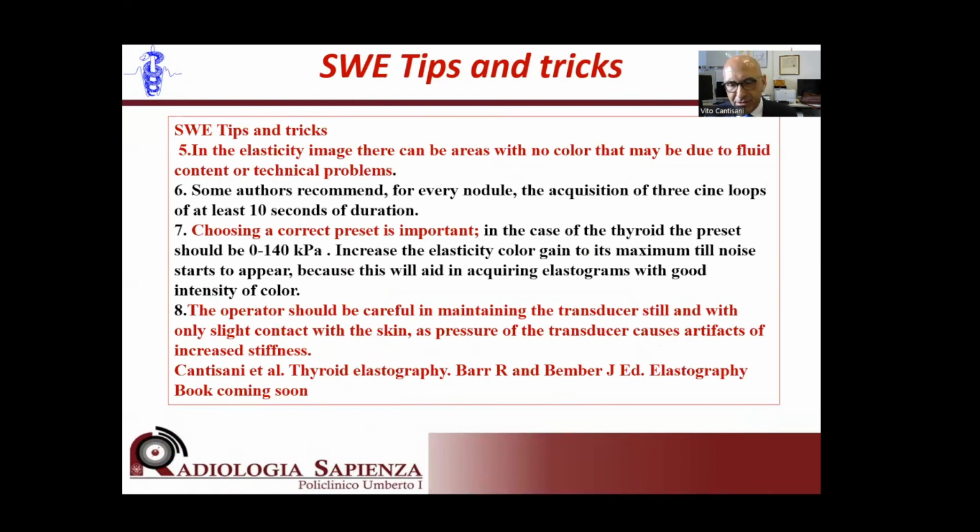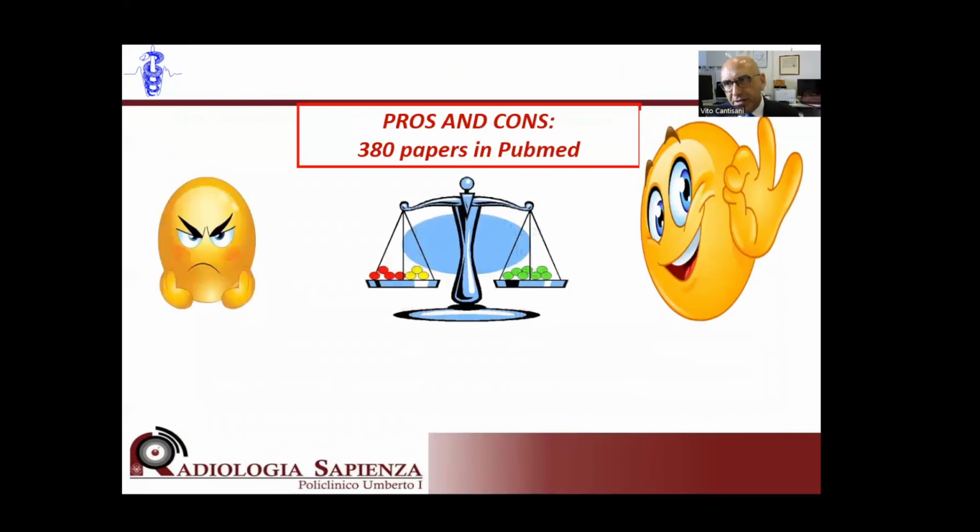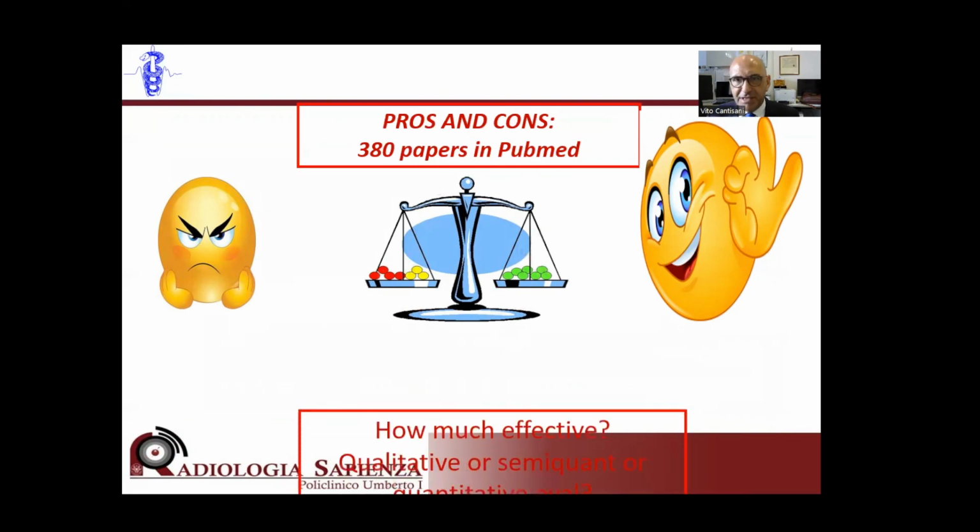And I would like to remind you that vertical artifact is still a limit. And although you don't compress, you may sometimes press too much. In the literature, most of the papers favor the use of ultrasound elastography.